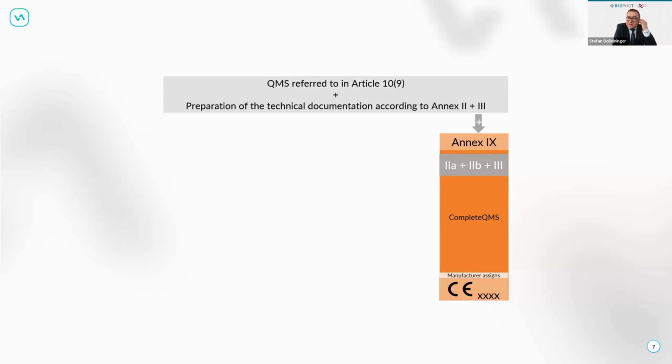But if you use, for instance, an imaging device used as an adjacent visualization of a certain part in the imaging, and this device is not directly connected to the human body, so it can be done with a bit of a distance, so the electrical standard does not apply, and also if the device is from its format, from how it was built, so generic that it will be a Class 1 product, then it would be a possible pathway to say, yes, Class 1.